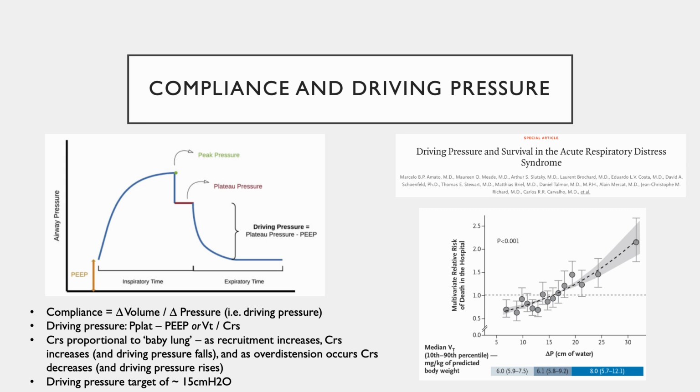The concept of driving pressure can actually be thought of as the flip side of the same coin when we look at the mathematical formula of static lung compliance, where it is derived as the change in volume over driving pressure. This concept was popularized by Marcelo Amato in his 2015 landmark NEJM publication, which showed that driving pressure was strongly associated with mortality based on mediation analysis of many of the landmark ARDS studies. A cutoff of approximately 15 cm water has been identified as a threshold for increased risk of mortality based on the chart shown on this slide.